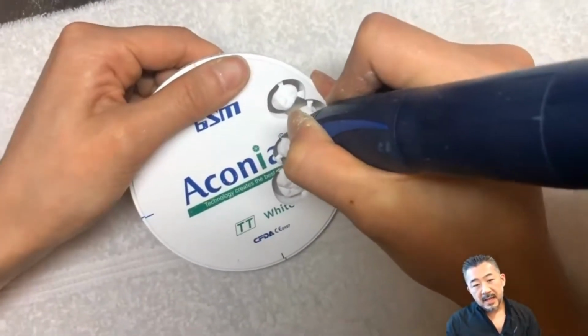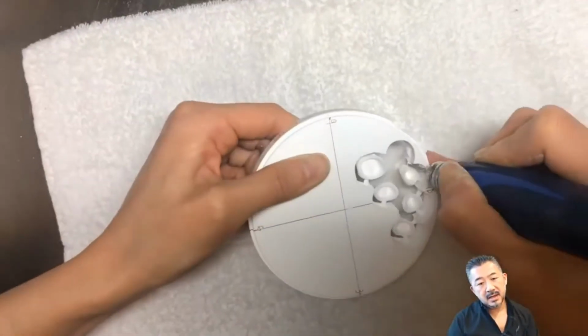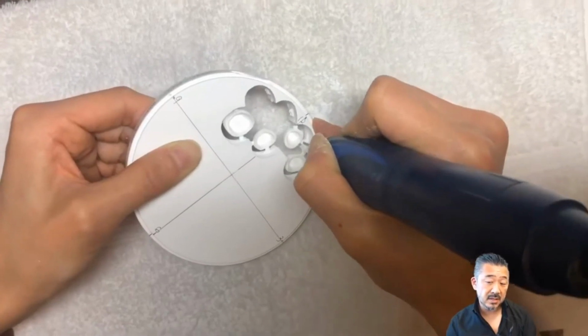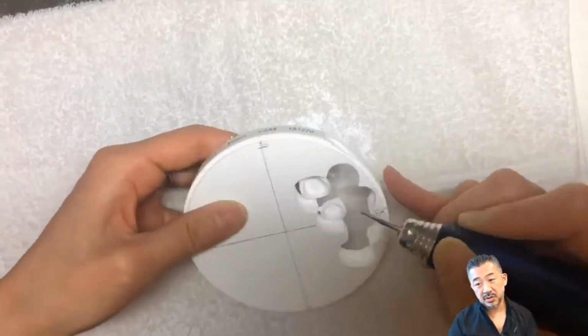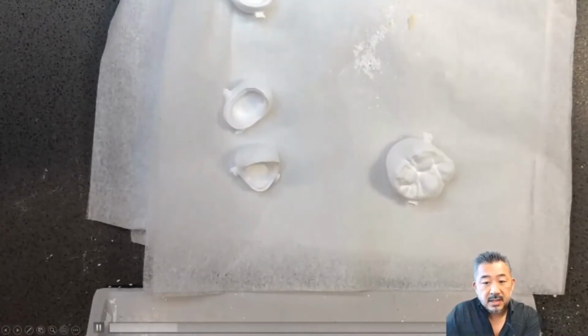In this video, the position lines are marked on the back of the disc, but the zirconia disc has a line marked on the front. So if you are using the Hyperdent CAM software, I think you don't need to mark the position line on the back. Well, anyway, when everything is cut, make the connector part smooth.